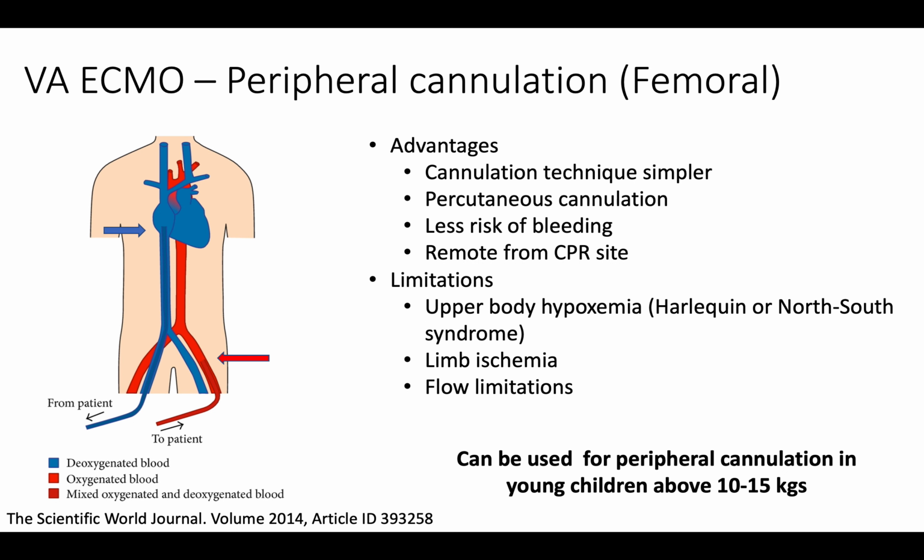A major disadvantage is the size of the cannulas that can be inserted. These are usually smaller compared to central cannulation due to the size of the vessels. In some cases, additional drainage cannulas may be required to achieve the recommended flow.